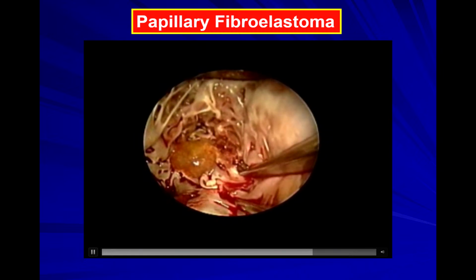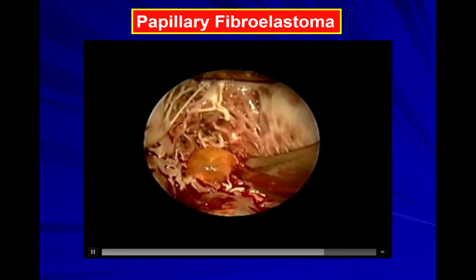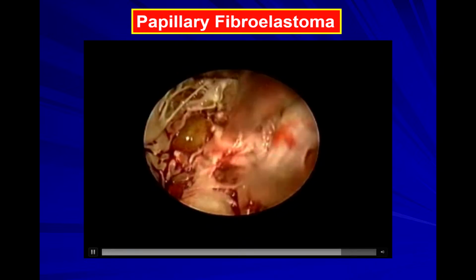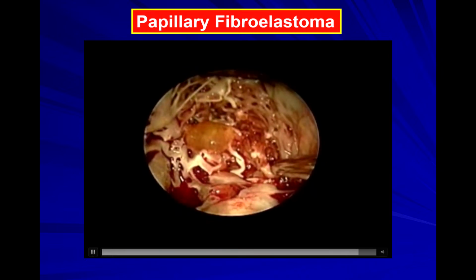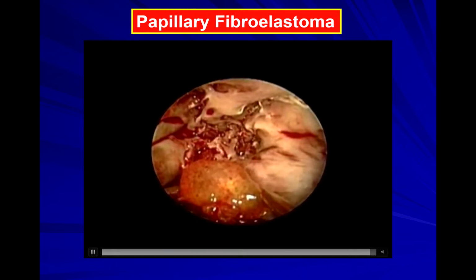But here you go. There it is. He's got a few more cuts, and he's going to get it unattached from all of those trabeculae in the apex. The apex is very, very trabeculated. And I'm guessing if I took a vote, everybody would think that that probably was a myxoma in an atypical location, right?